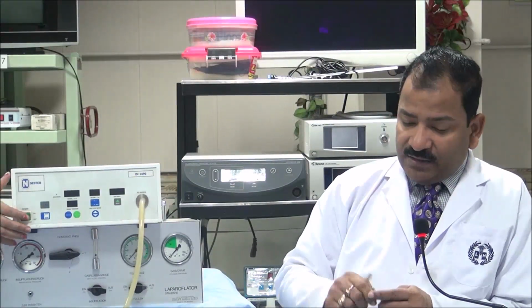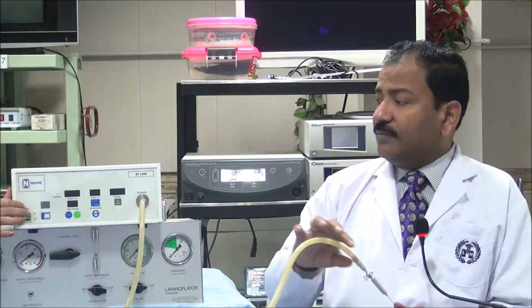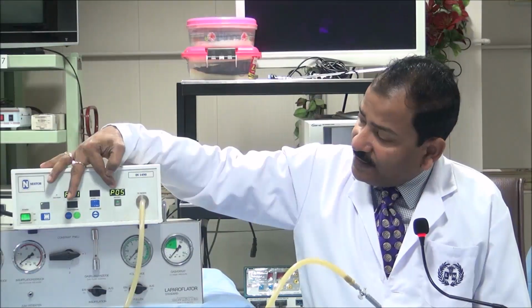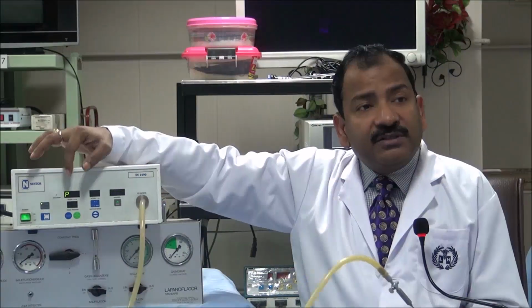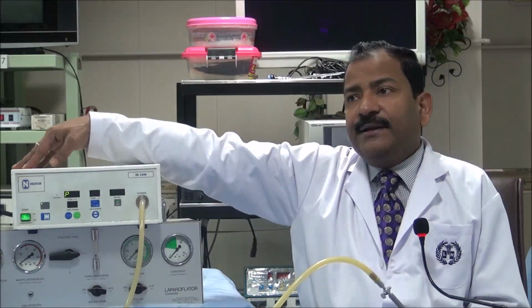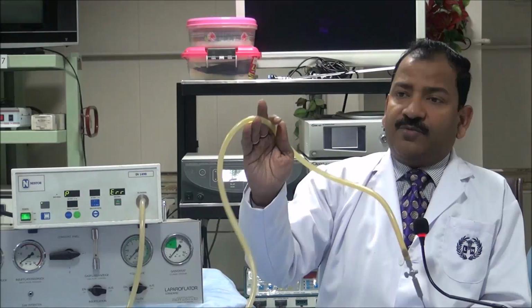Here this is important. You will see that as soon as it is introduced, it will give you the error. The reason for this type of error is that the Veress needle was introduced first. Why? Because right now there was air inside this tubing.